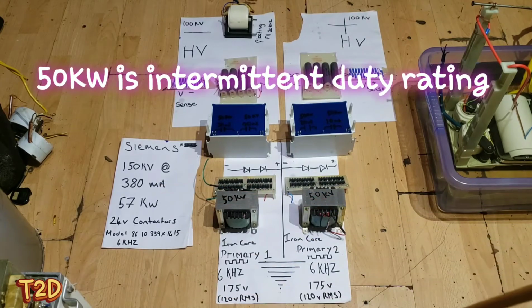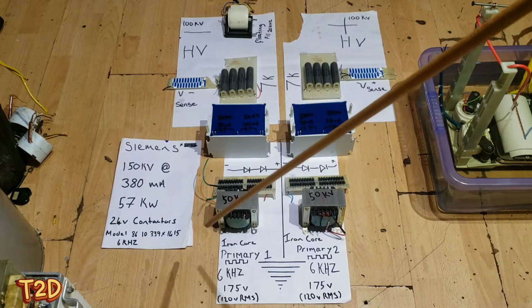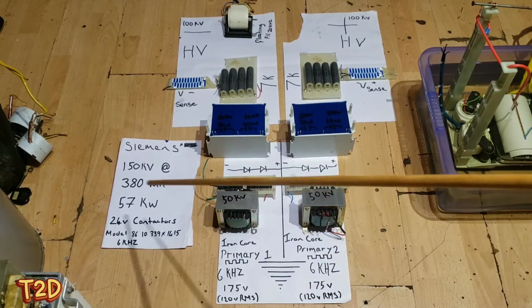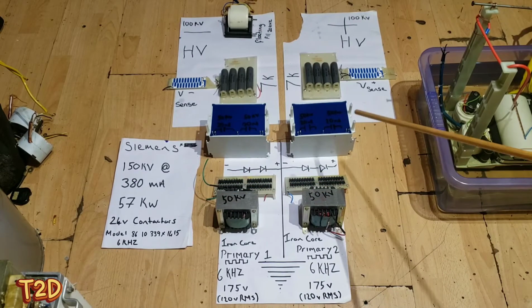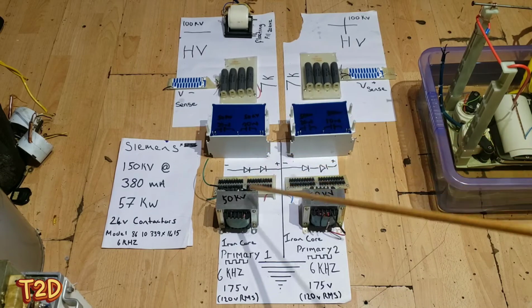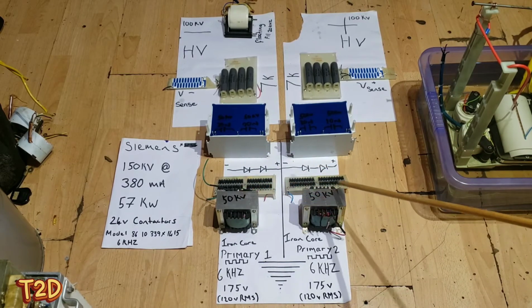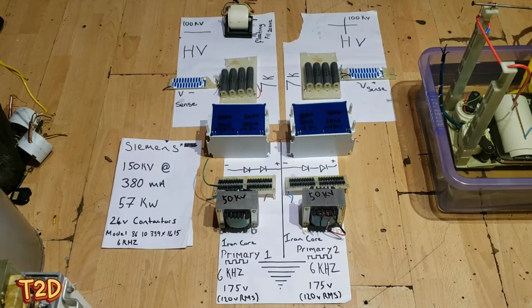Now from experience I can tell you that these put out quite a bit more than that. I mean, I've had over 200 kV. I'm not saying it's a good idea to do that. Obviously this is the rating, so we should really stick to that. Some of the ratings on these caps and transformers etc. are, from my experience with these things, rated at 150 kV, but they would have to have some margin above that.